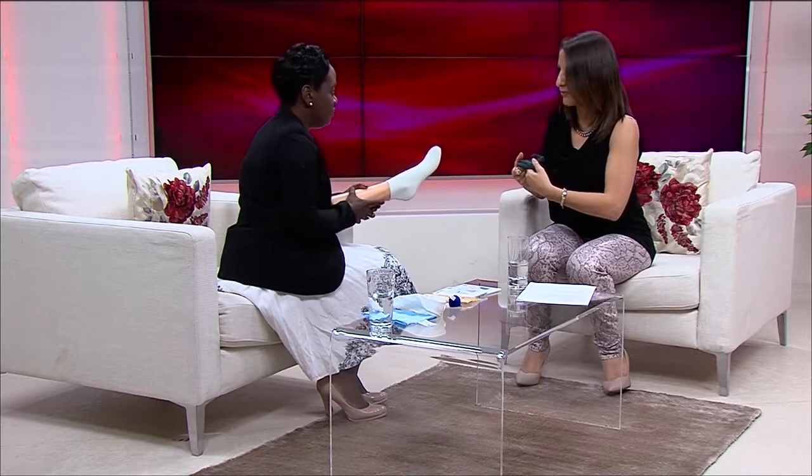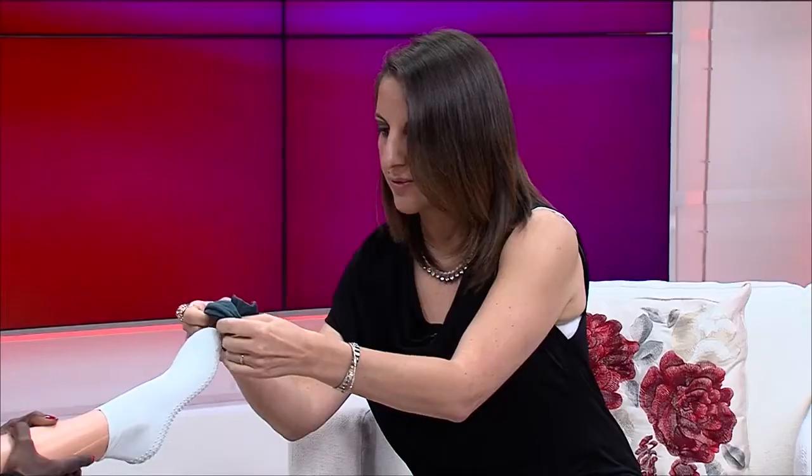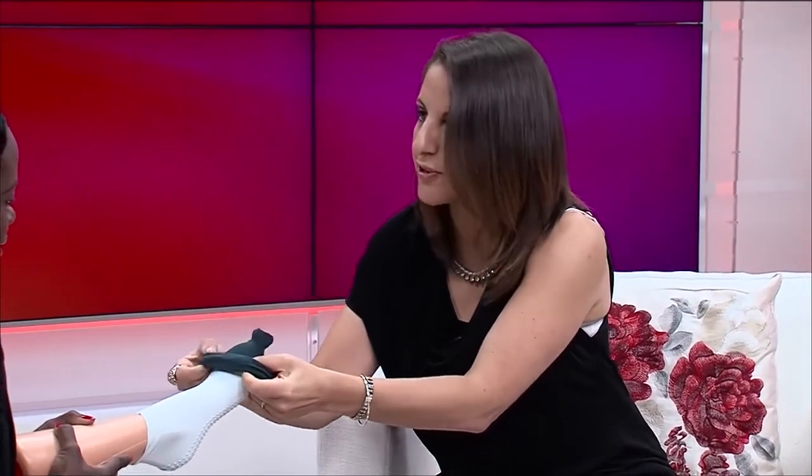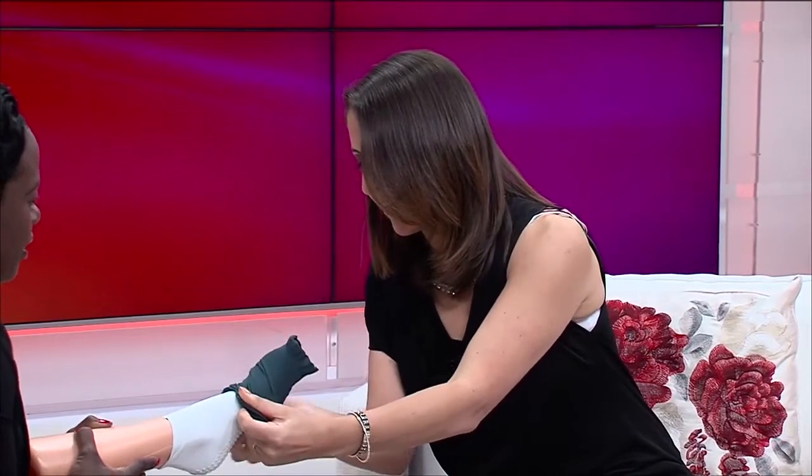So if you just imagine that I'm like an 80-year-old lady, and obviously you want to be very gentle. Please be very gentle with my leg. So I would be. That is quite hard. Oh my gosh, I'd probably break your foot. It's very difficult, and for a nurse putting these on every day, it's quite... I would actually be quite scared to even force that on. Yeah, it is really difficult.